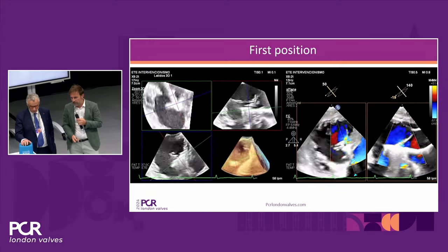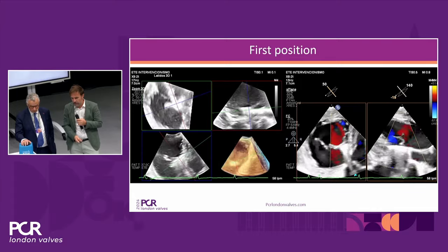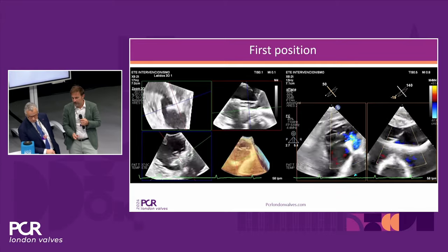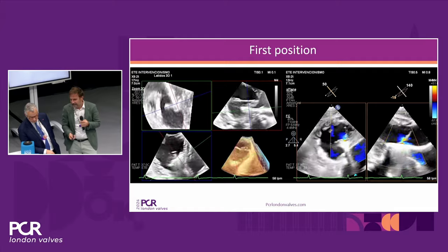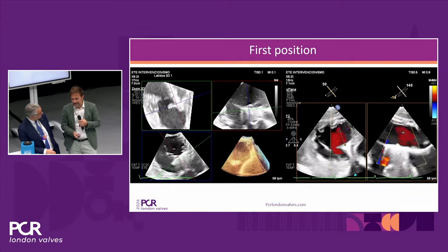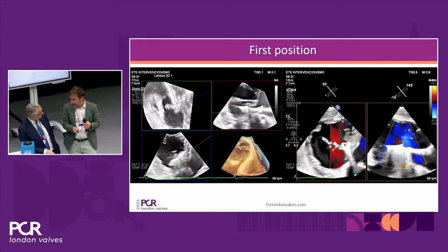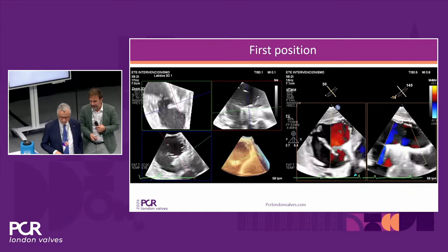Despite having a good grasp, you can see a really nice MPR reconstruction. You can see that we have leaflets. We are sure that we have a good grasp. There is a good pyramid. But despite that, we are not fixing anything. We can agree that it looks exactly the same as at the beginning. In this particular case, there wasn't a large dilatation of the annulus. We really believed that it was post-trauma, so it's a primary TR. So you have to fix the point that is lacking.